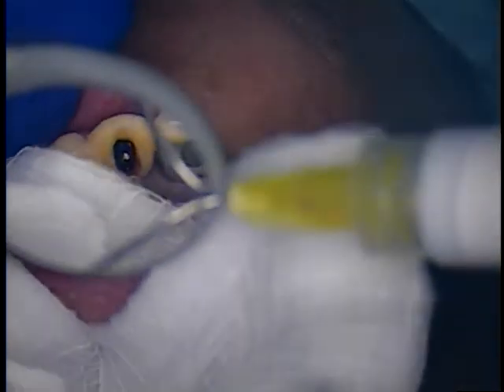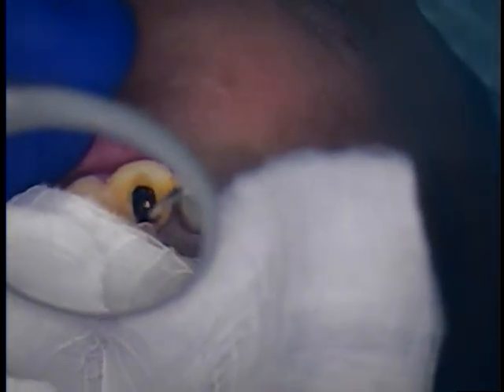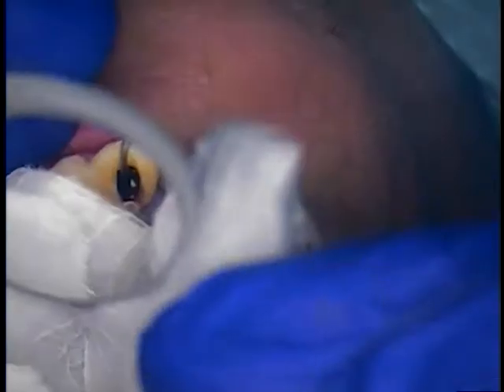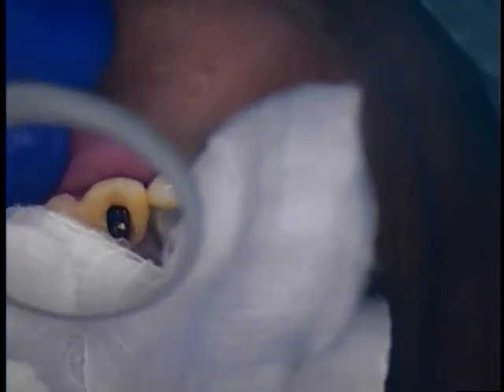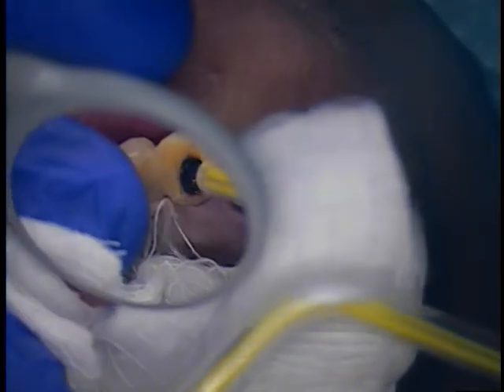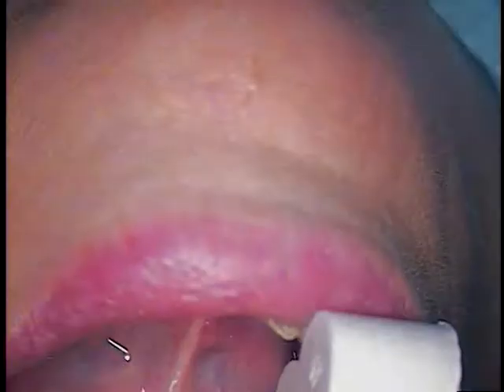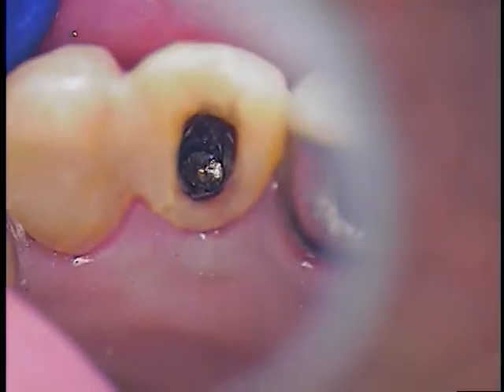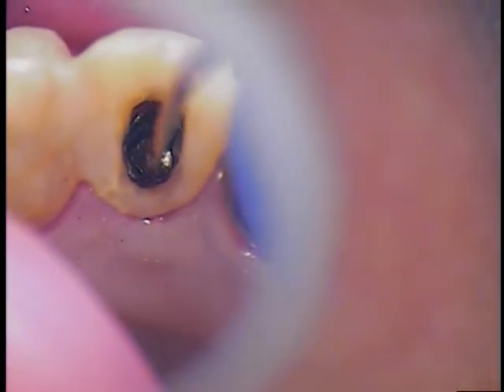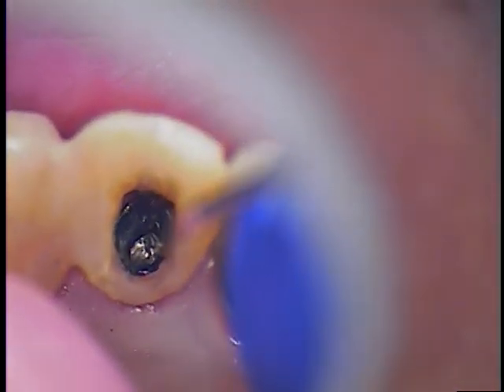Okay, get a hold of that. Now, same thing, I'm going to go in a counterclockwise rotation. Let me see if I can just hold this. Well, it's coming. Nope. So we're going to put some water down in there, and we'll just continue to spin it. I don't have to pre-soak this one with any kind of solution, but we're just going to continue to use an endodontic explorer and see if it comes quietly here. Come on now. Okay, another spin.